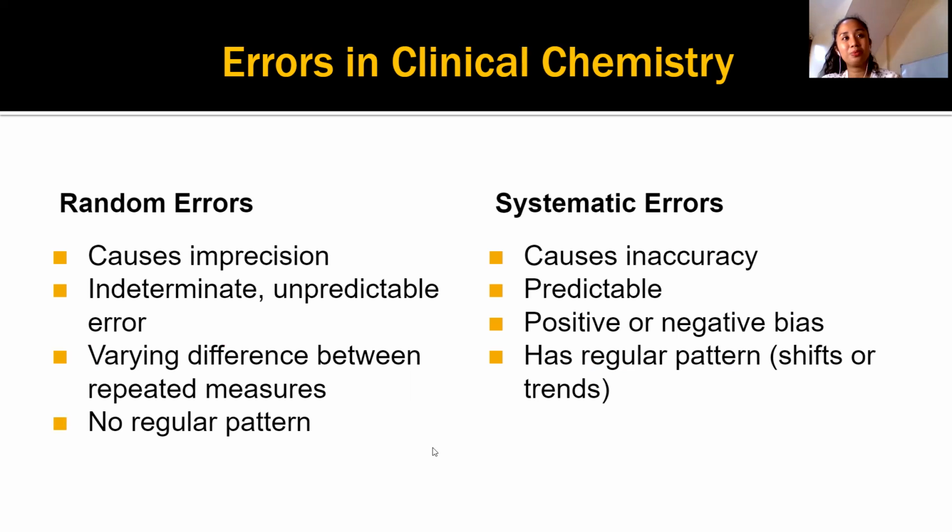Yan. So, biglang may nangyari. Biglang si Medtech, mali yung napipet niya. Imbis na sabi ko, 1,000 microliter, 50, since hindi niya alam mag-convert ng ml to microliter, 500 microliter lang nilagay niya or 10 microliter, 'di ba? Hindi niya alam mag-convert. So guys, yan.